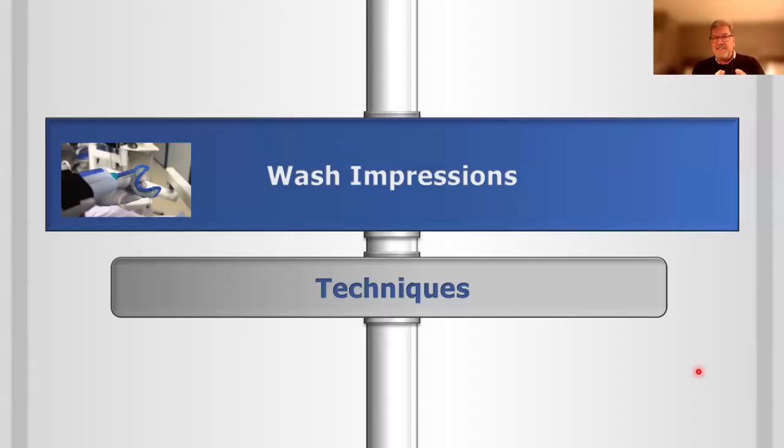So, the reason why I stuck this in here today on wash impressions is that, with digital technology now, and we'll talk about this in a few minutes, with scanning fully edentulous arches, most doctors are still having difficulty capturing all the anatomical landmarks we need for a successful case. So that's when I tell everybody, digital technology on dentures, many times it's not fully digital.